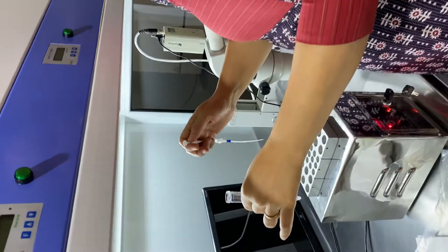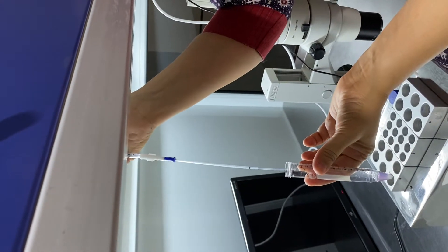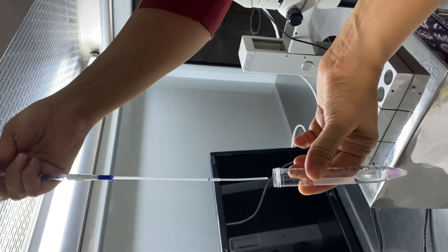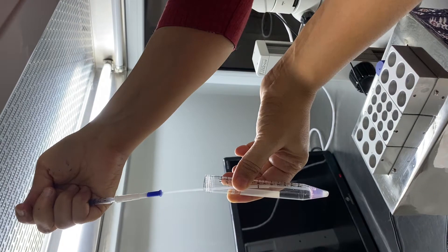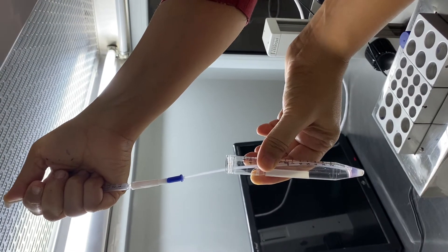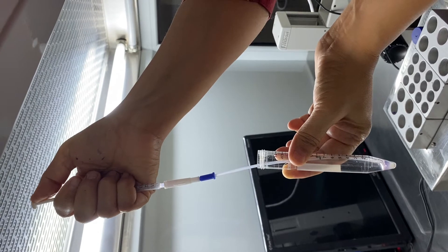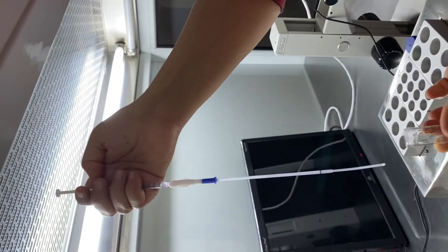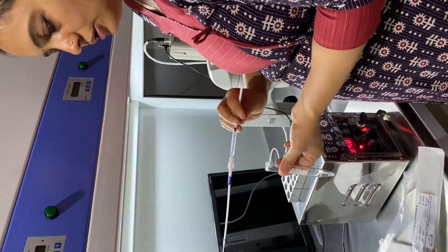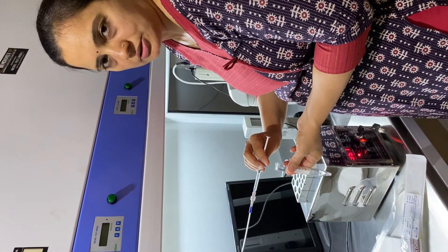Ideally this should be done under laminar air flow. Here I am going to load the catheter. The vacuum is already generated inside and I am going to load the catheter. That's all — 0.4 to 0.5 ml. This is the catheter prepared to do the IUI. Now gently you can give it to the surgeon or consultant who is performing the IUI procedure. Thank you.